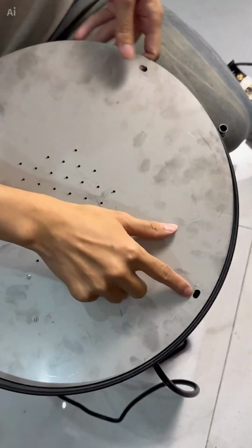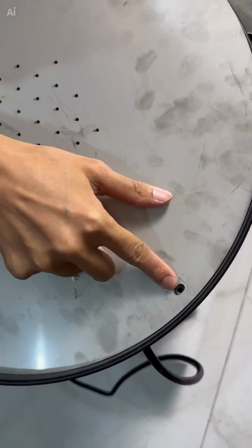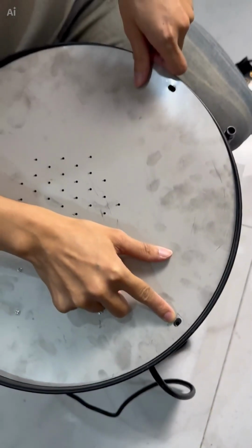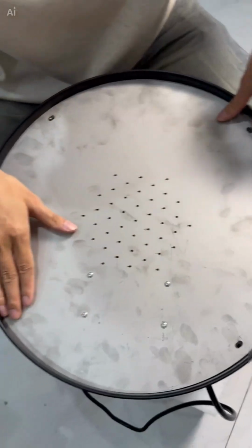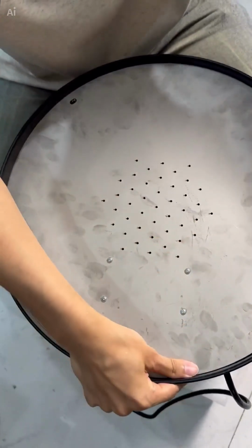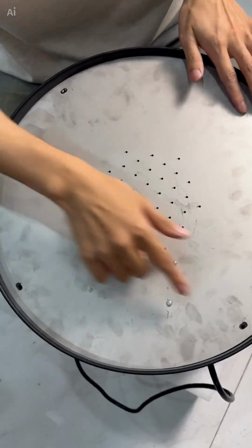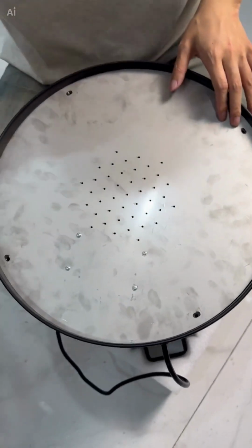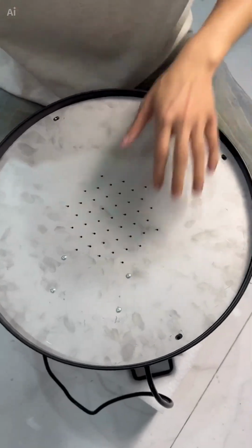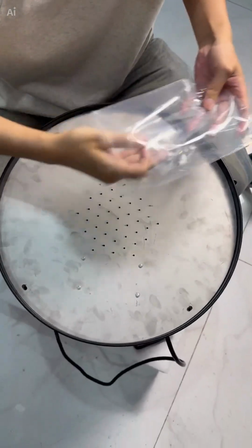Looking at this hole, we can look at the hole, rotate to find the hole underneath, and then smoothly place the base plate down. Put it down. Okay, now you can see that the holes on our base plate align with the holes inside the cylinder below. So we can start screwing them together. We just used this screw.